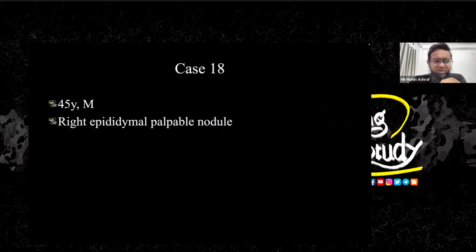Okay, now case number 18. This is a 45-year-old male patient who came with a right epididymal palpable nodule. Oh, okay. So I have chosen a scrotal case actually. I thought that I had not taken any scrotal case today. So anyway, this is a right epididymal palpable nodule. So let's see what we have got on ultrasound.